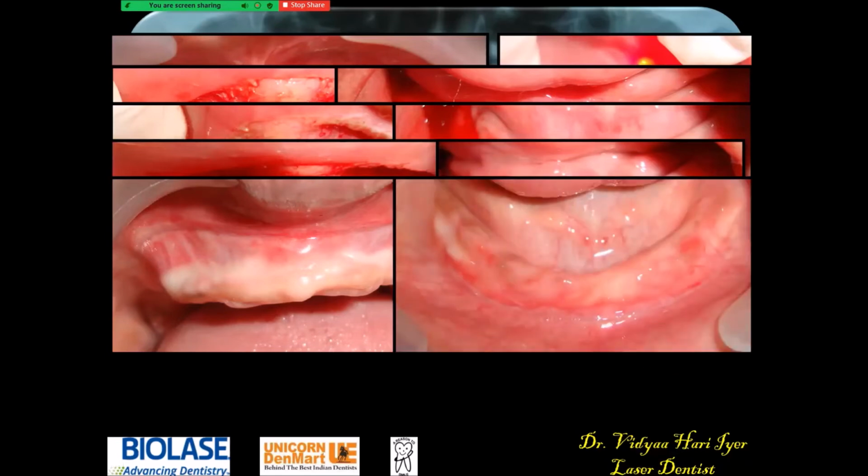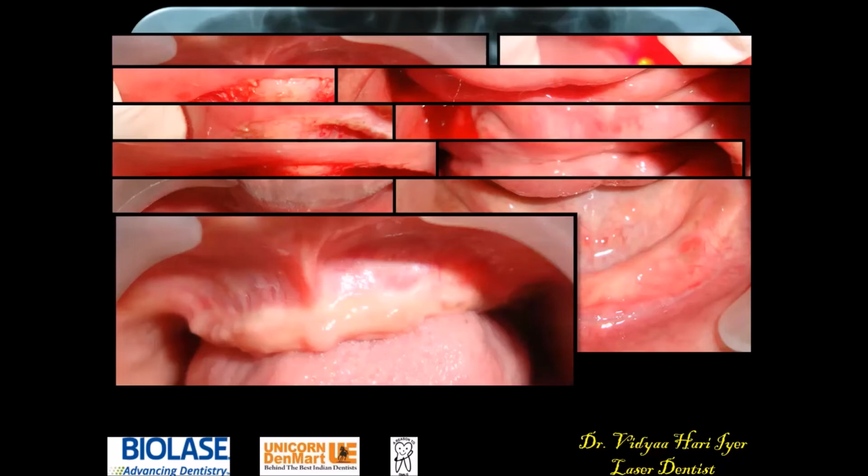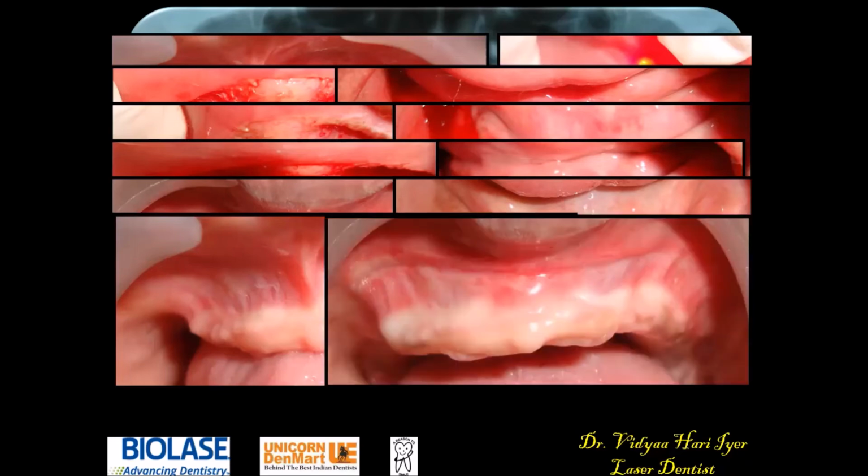Now, if I had only a diode laser in my practice, then this is how you will get a scar. And when I have the erbium, the hard tissue laser also, this scar will also not be there. You might say it's only inside my mouth. Who's going to know? We take pride in our work. It's like an autograph which we sign on every patient's mouth, right? And that is why you can see here, absolutely, the healing has been fantastic, and the patient can go ahead with the dentures. You can see that in the upper as against how it was, right?